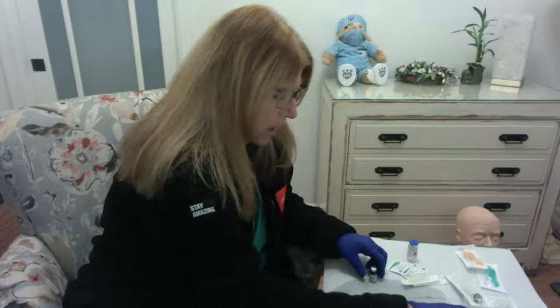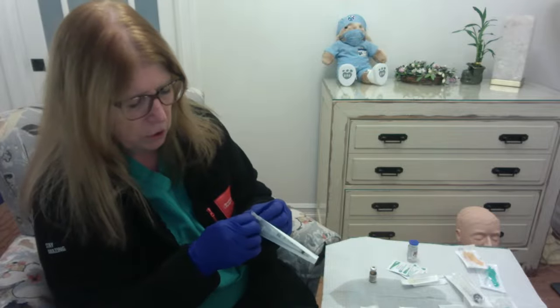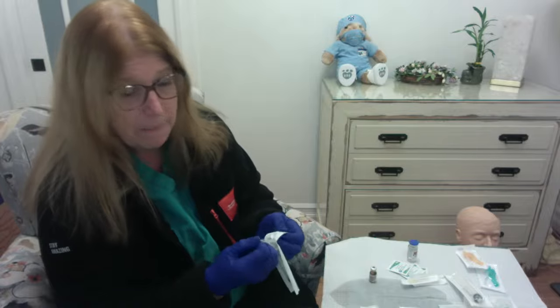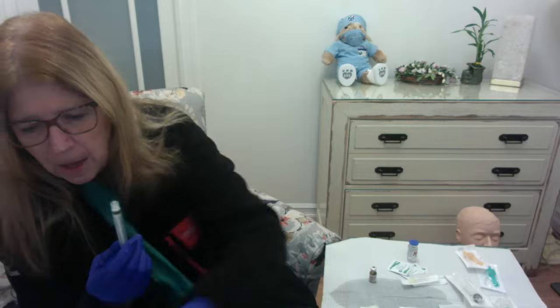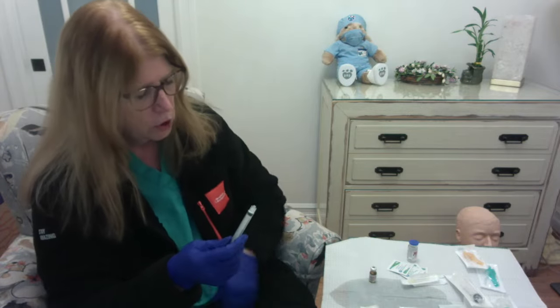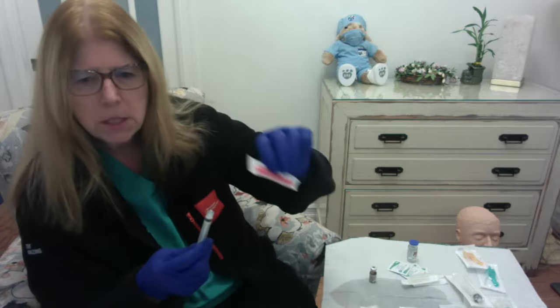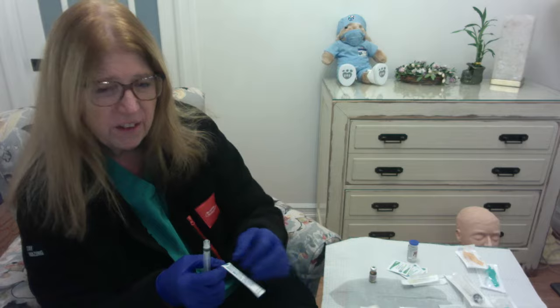So let's get our 3 milliliter syringe, because I'm going to take a milliliter out of that vial. So I'm going to open this up. And we also have another type of needle, which is referred to as a blunt needle. A blunt needle, and it says it on the package, blunt fill needle.